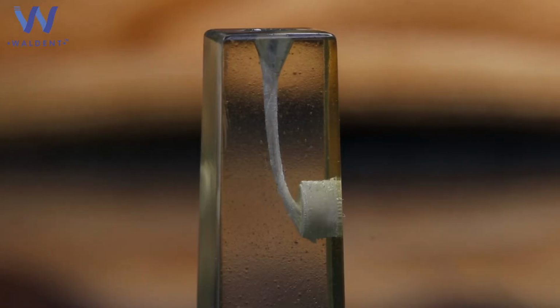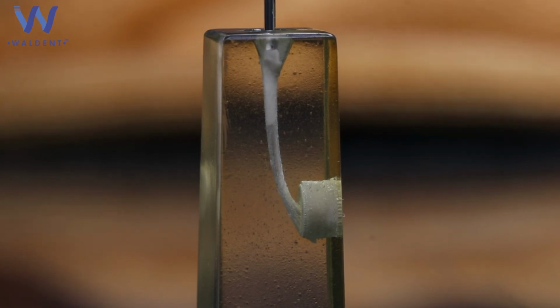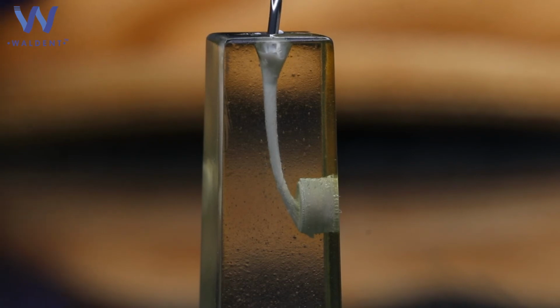Now insert the dispensing tip into the canal and inject a little bit of material into the middle and coronal third. Make sure that the dispensing tip is moving freely in the canal without binding. Keep injecting RCTcal into the canal till the entire middle and coronal third is filled completely.